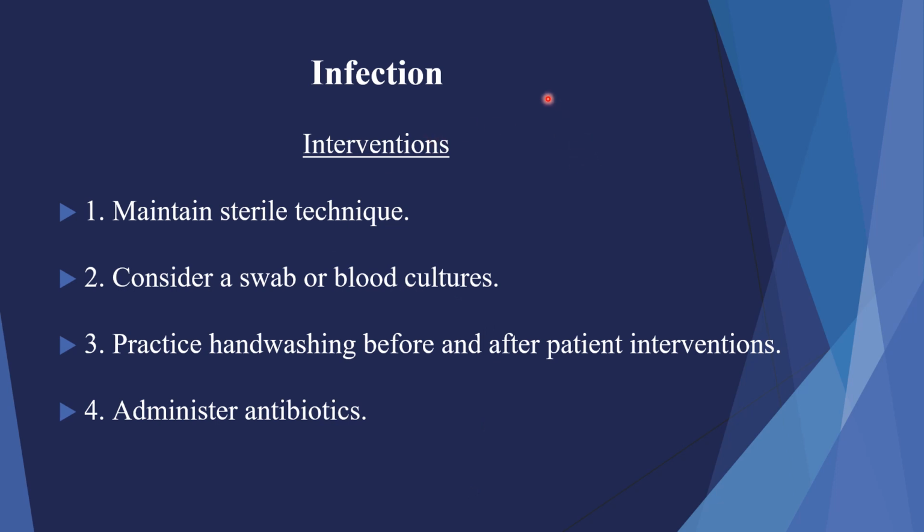Interventions to help prevent infection. This is really pretty much the same as any invasive line anywhere. If you've got a central line, you want to maintain the sterility. It's an invasive line. It's an open port that's just waiting for something to get in there and take hold and cause problems. So think about it the same as a central line or anything along those lines.